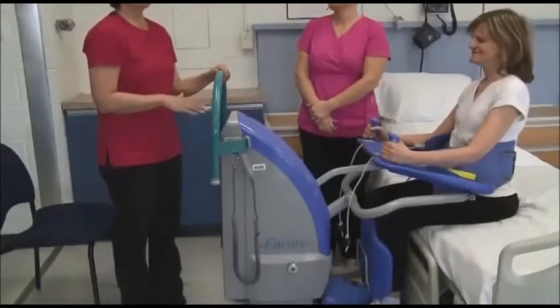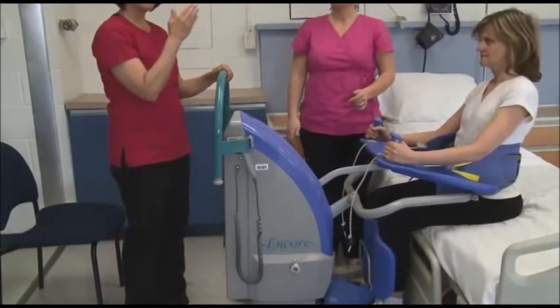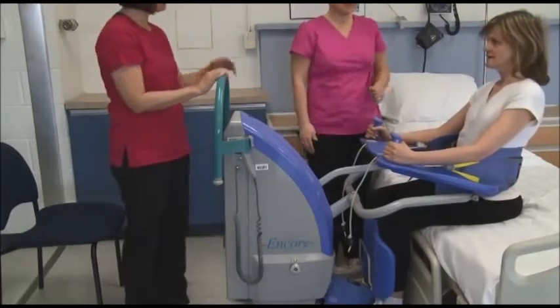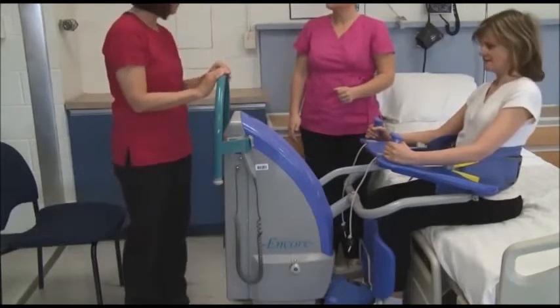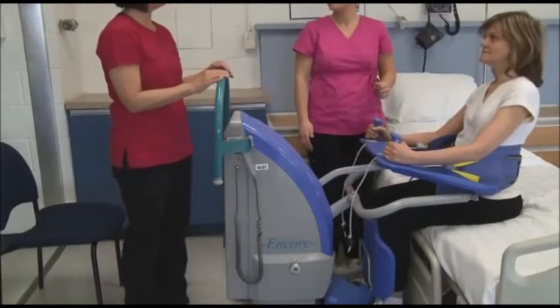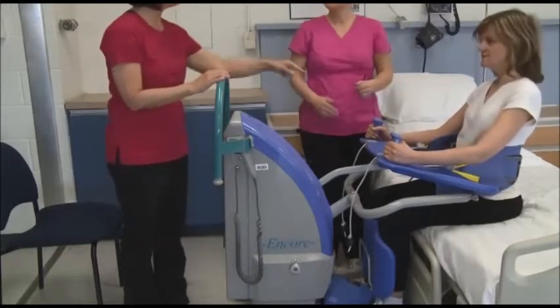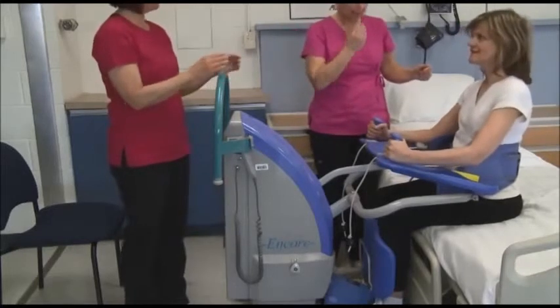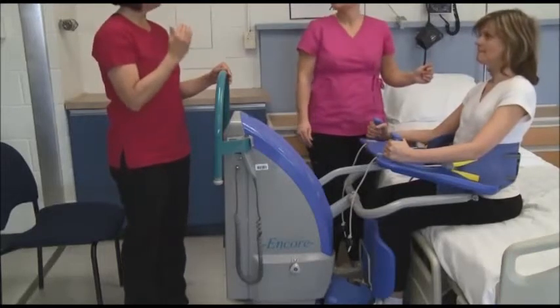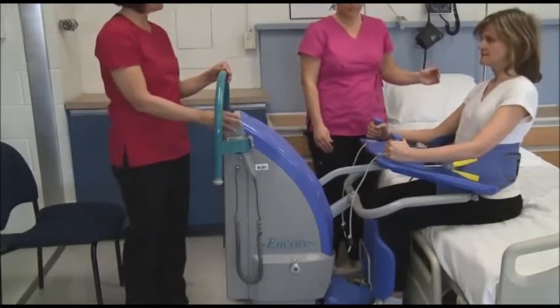Okay, so with our brakes on and our safety belt intact, on 3, we are going to assist Carmen from sitting to standing. And it's very important that Tracy and I work collaboratively, but that we also work collaboratively with Carmen, because it can be a very scary feeling for a client to be lifted up. So Carmen, it's important that you hold on, and when you get the opportunity, I want you to stand as if you are standing erect yourself, okay? The machine will help you, but to stand straight, okay? And in one motion we'll go.